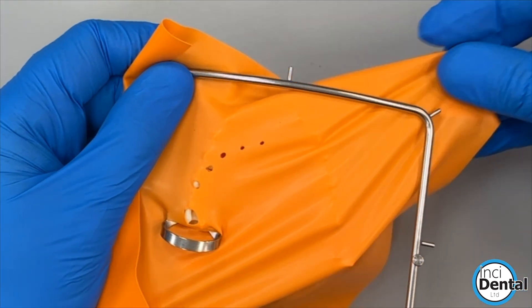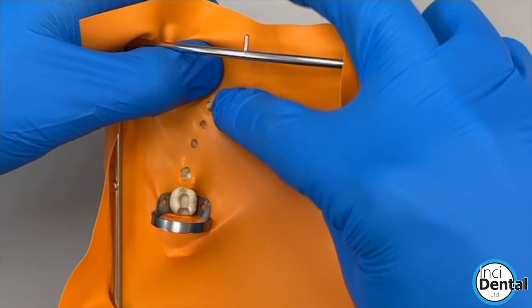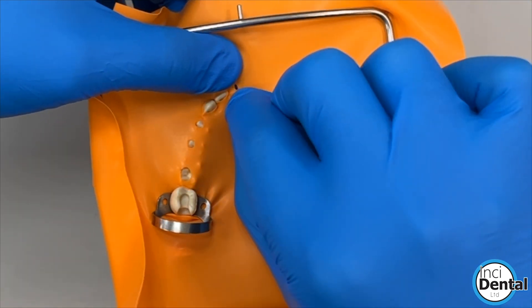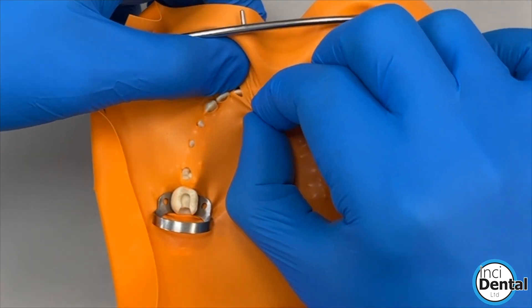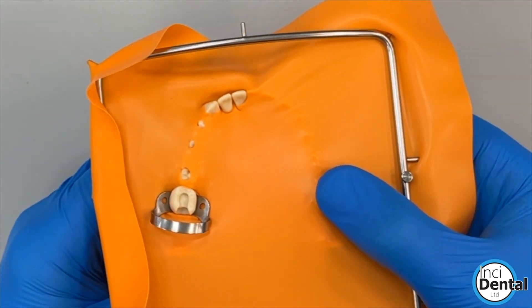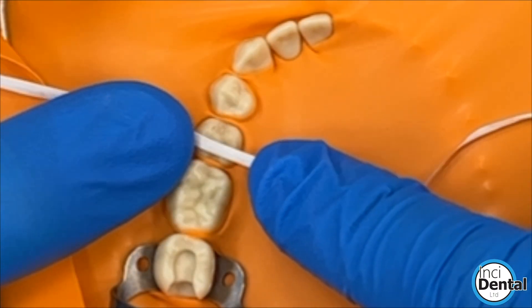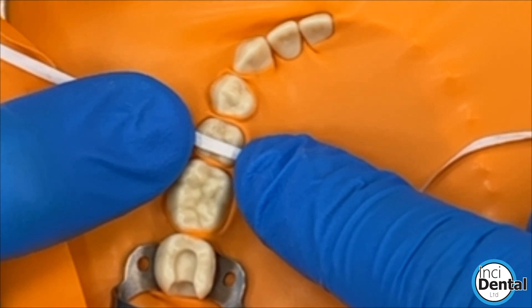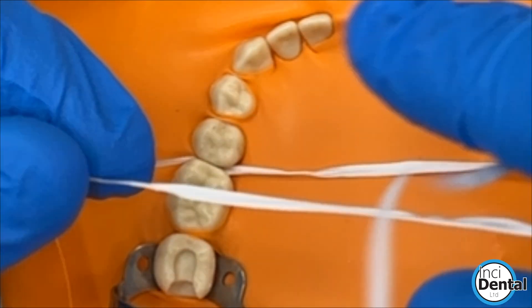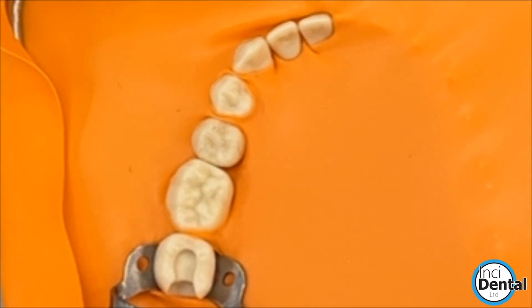Place the frame. Start by trying to get at least something down at the front. The way to floss the contact is you start in the middle of the tooth, bring it down, roll it in, come over, start on the other tooth, bring it down and pull through.